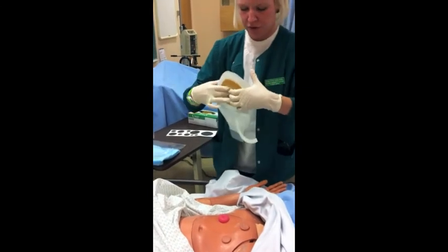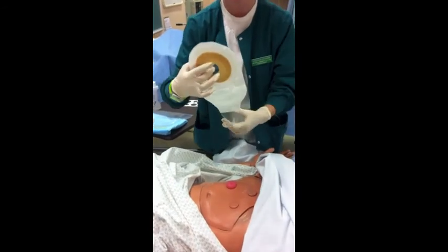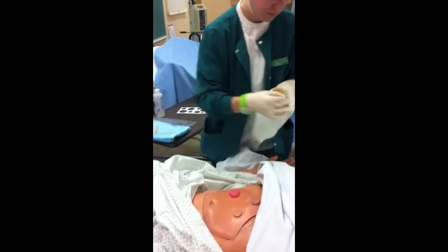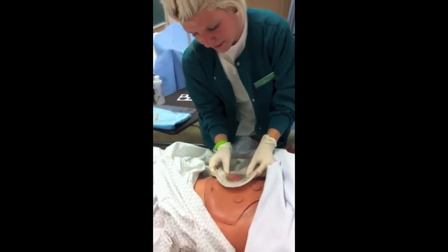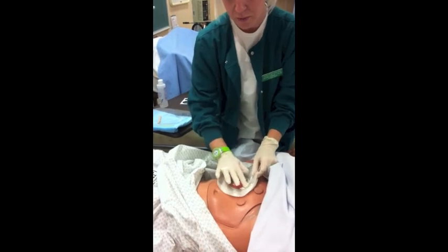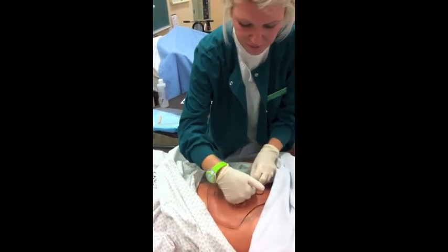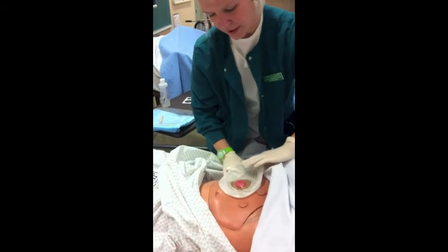I'm going to fit this over the stoma, and I'm going to position the bag in a place where it's going to be easy to clean and out of the patient's way and the most comfortable for them. It fits properly. I'm going to put my hand over the plastic adherent just to warm it to the skin a bit for placement. And I'm going to make sure that the adhesive is smooth and properly placed.